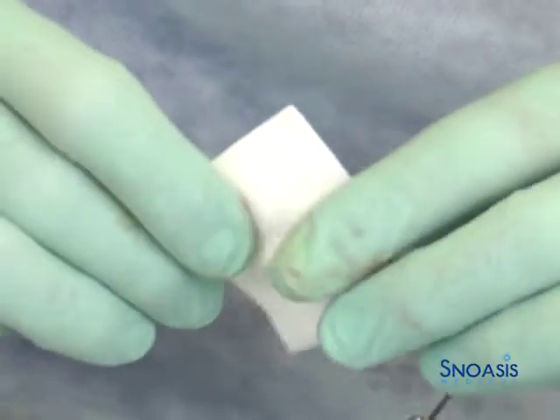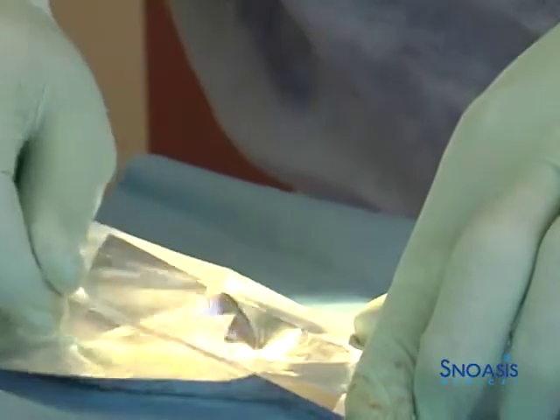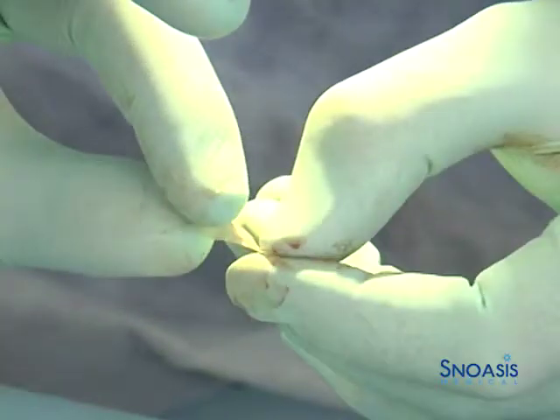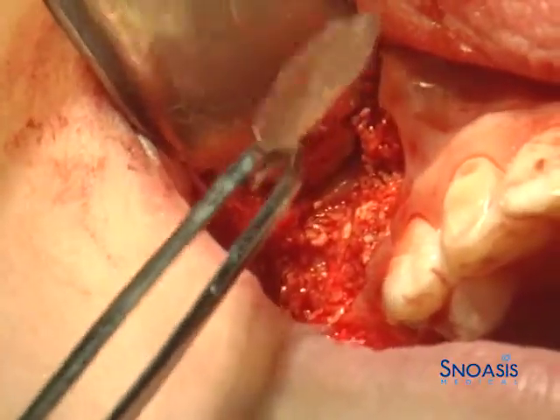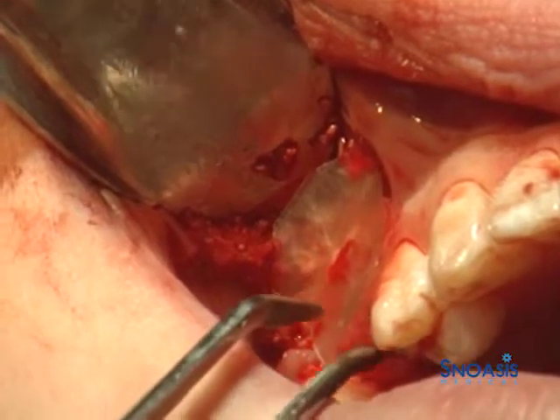This protocol reveals drying of the gloves prior to handling of the bioexclude membrane with cotton gauze. The bioexclude membrane is opened from its packaging and is held with dry hands. Handling of the membrane is best served with dry gloves to prevent sticking. The membrane is fragile in its initial state, but as it absorbs blood it becomes significantly tougher. This image shows a trimmed bioexclude membrane consistent with prior protocols.